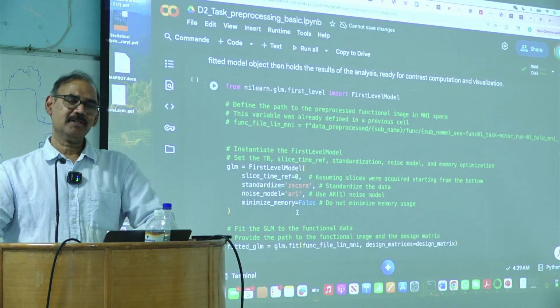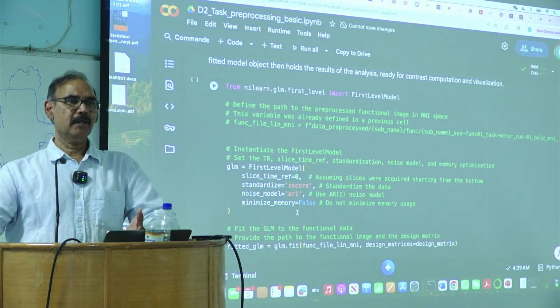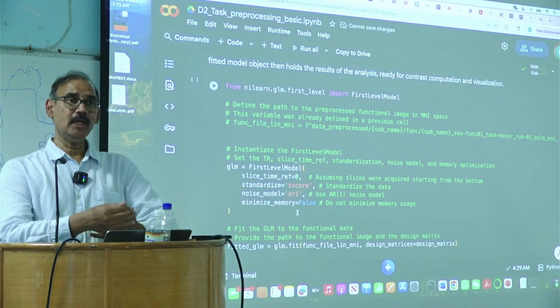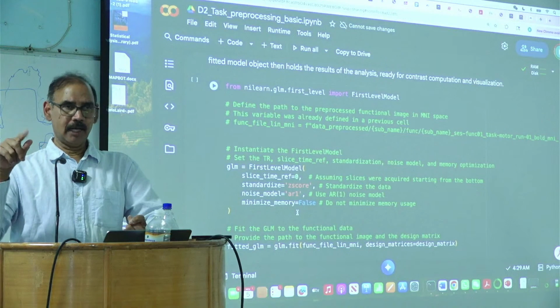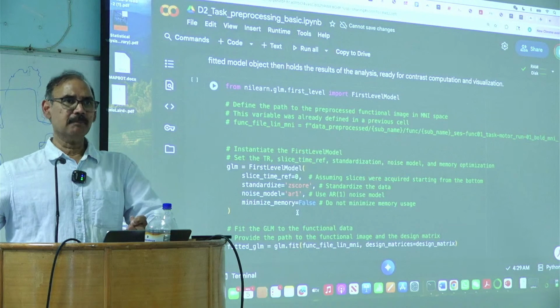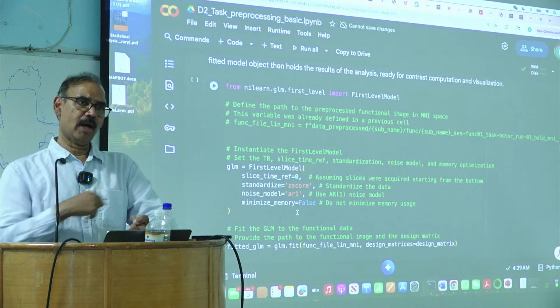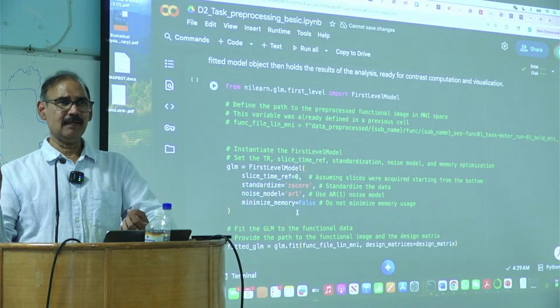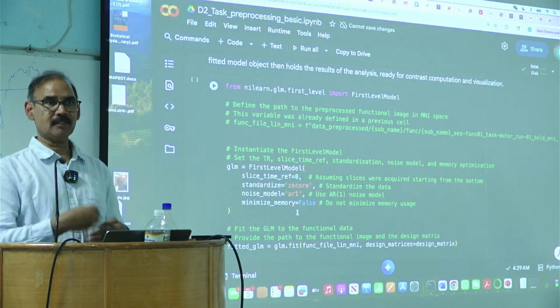Autoregressive means that the current value is dependent on the past value. It doesn't have to be wholly dependent. It could be like x_i equal to random noise plus alpha x_(i-1). The alpha is how much dependence you have. If it is, let's say, 0.1, then it's a small amount, but if it's 1, then it has a much bigger effect.